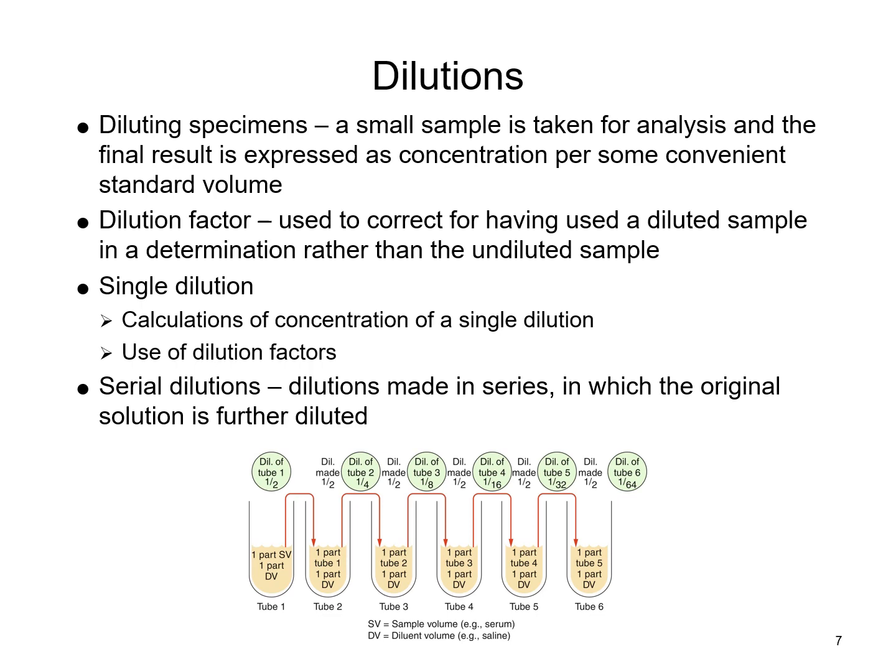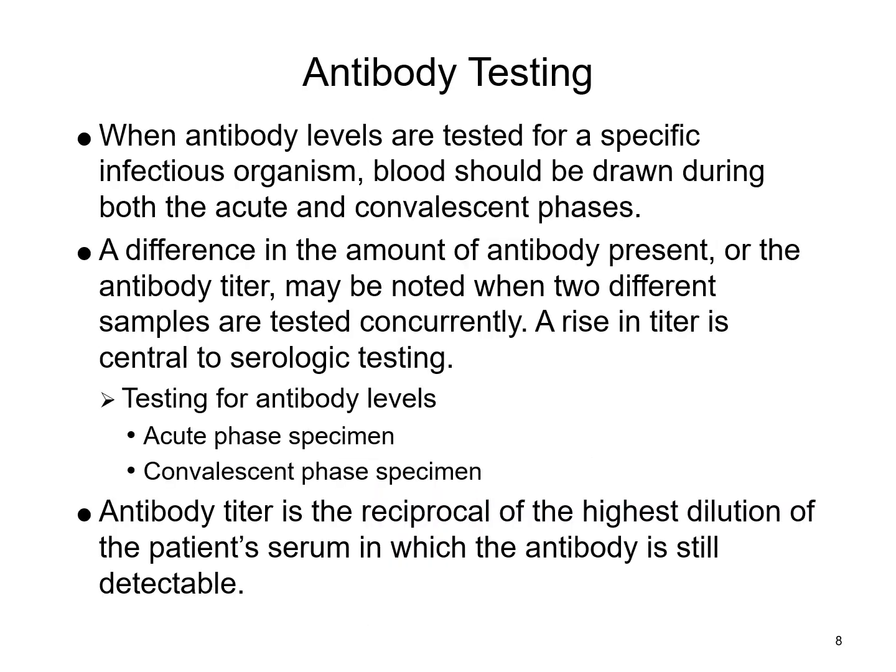So we're going to talk about that here next. When obtaining specimens from a patient for serological testing, it's very important that we consider what phase of the disease and the actual condition of the patient when we draw and collect that specimen.